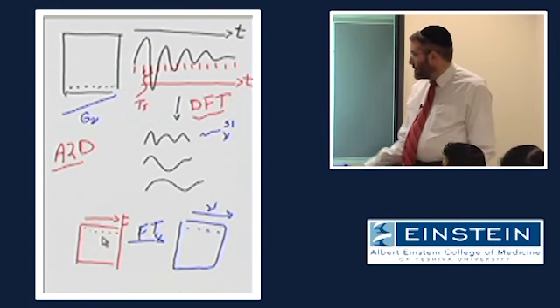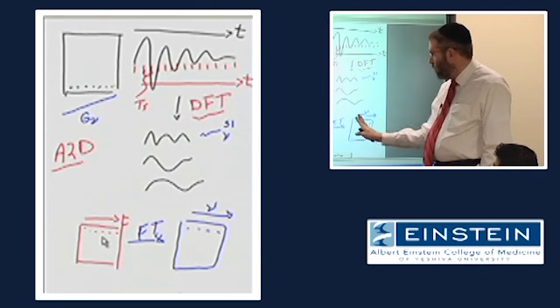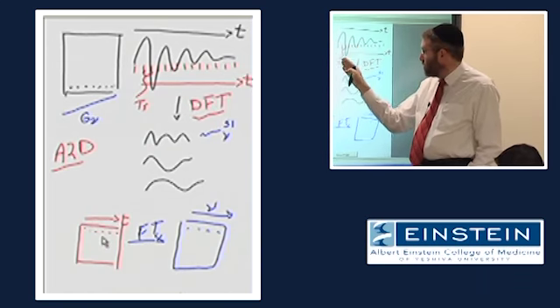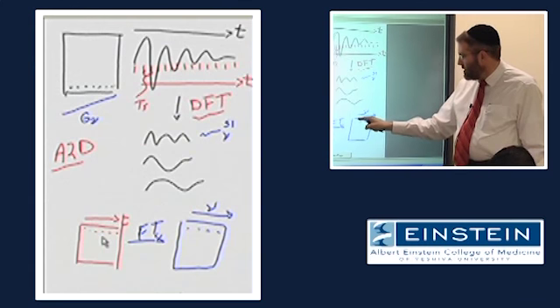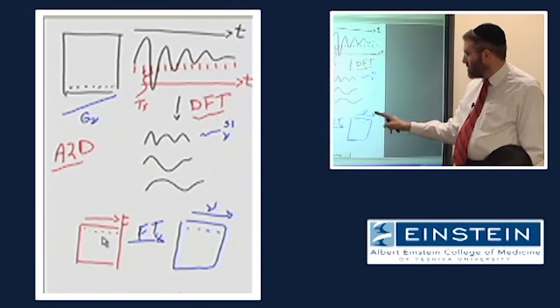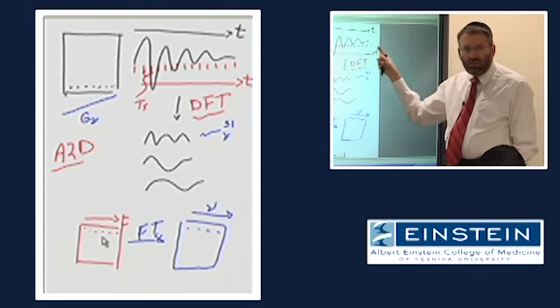So what the Fourier transform is allowing us to do is to go from what we call the time domain, measures of signal amplitude that correspond to points in time at which we acquired them, and convert those into measures of signal amplitude that are associated with different frequencies that were components of this aggregate signal.